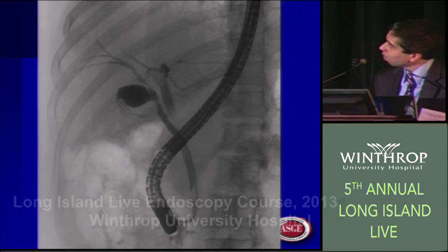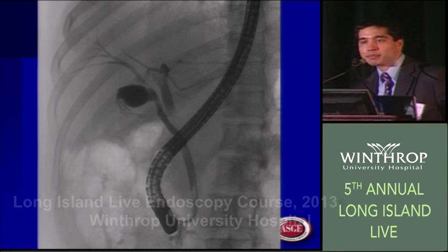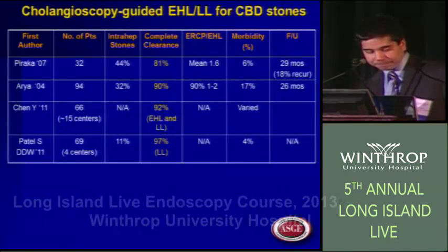Now, I have to admit, I ended up putting a stent back in because I wasn't sure if there might be something hiding right up there, so I'm going to bring her back for one more cholangioscopy, which the patient was pretty disappointed with, just to be sure that there are no other stone fragments there.